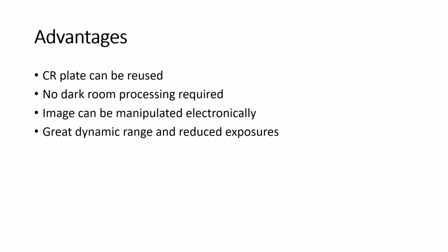That means the CR plate can be reused, and the CR system does not require any darkroom processing. It is a very tedious procedure in the conventional radiography system, so CR eliminates the darkroom requirement.